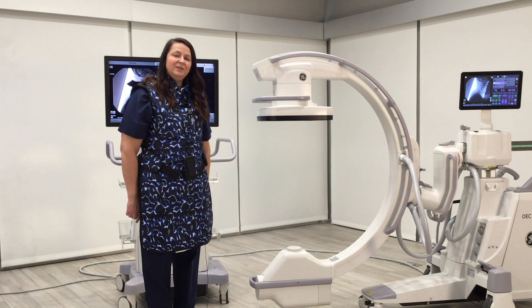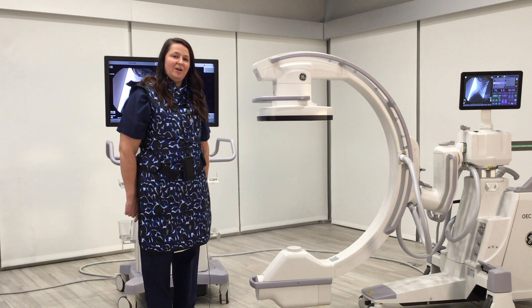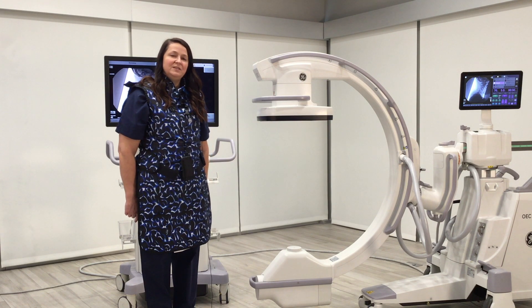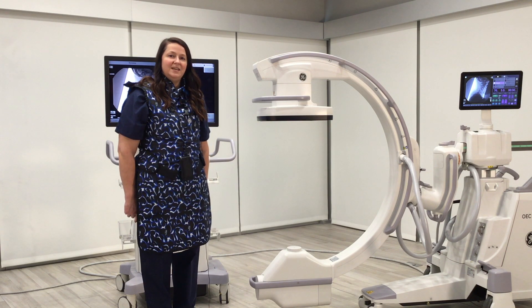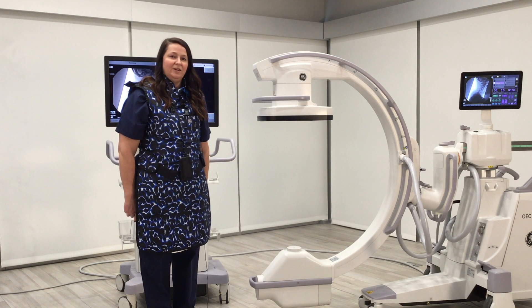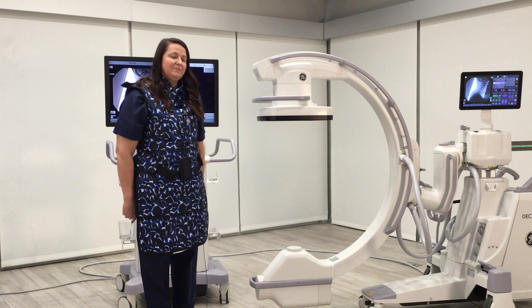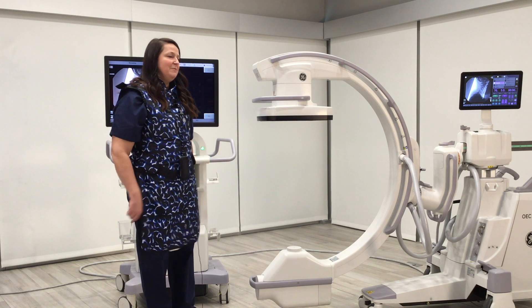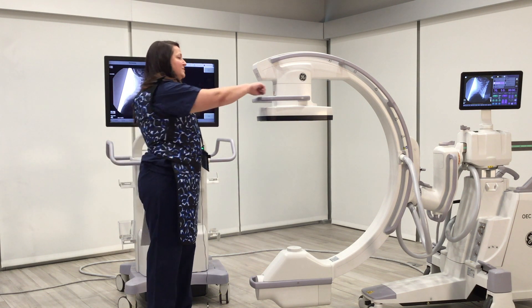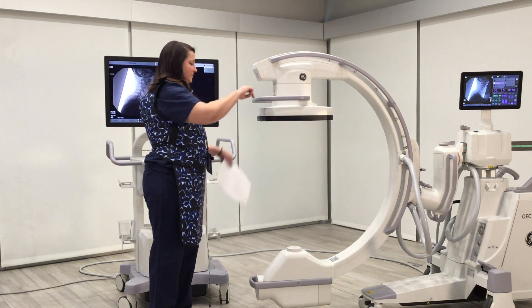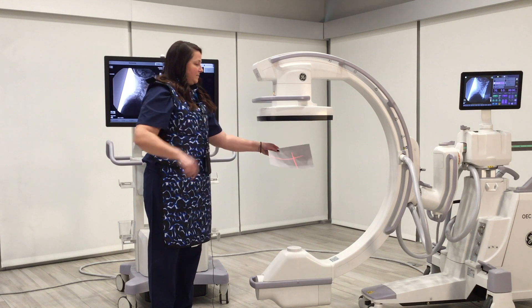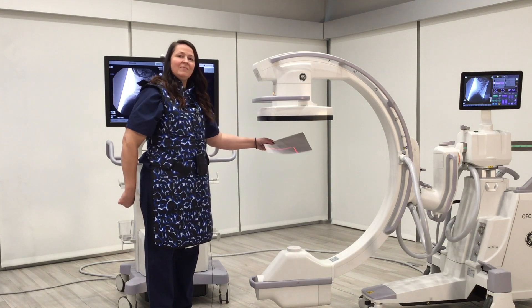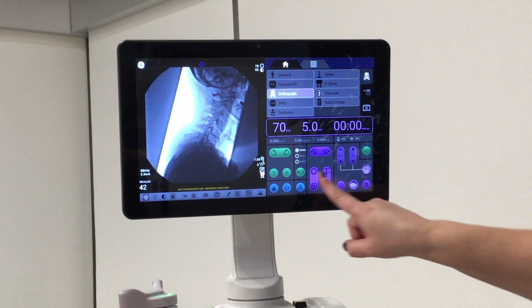When available, utilize the laser aimer in order to reduce the number of shots taken while centering over the anatomy. The laser aimer can be turned on from the front of the C-arm and also from the tablet.